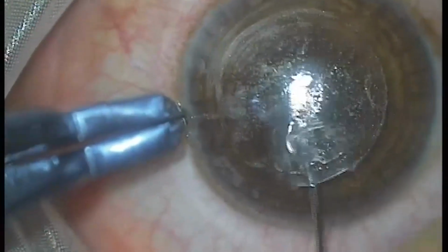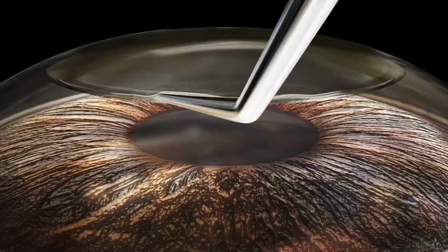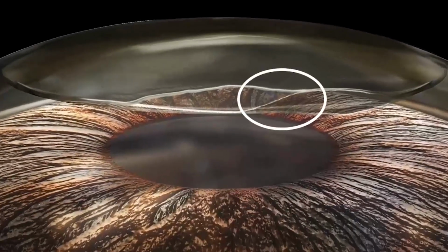The lenticule was brought out with the micro forceps after completing the dissection. Graphical video shows a beautiful description of the sign confirming correct plane dissection, that is anterior plane prior to posterior.